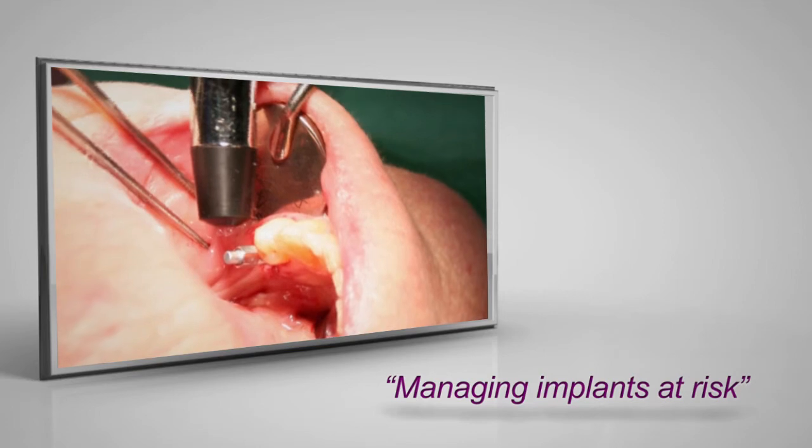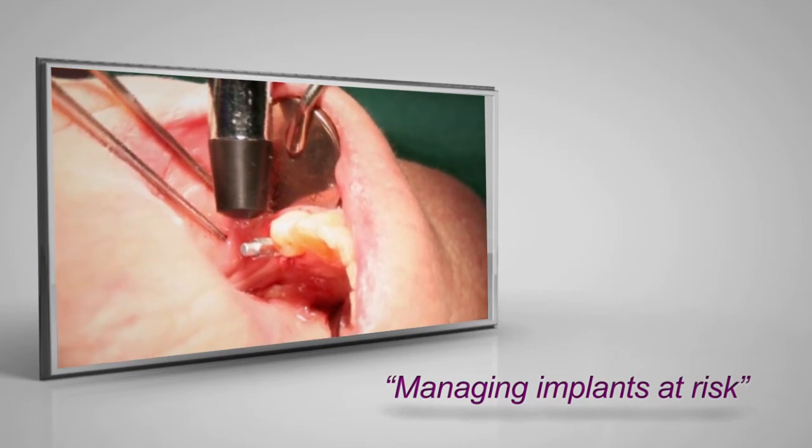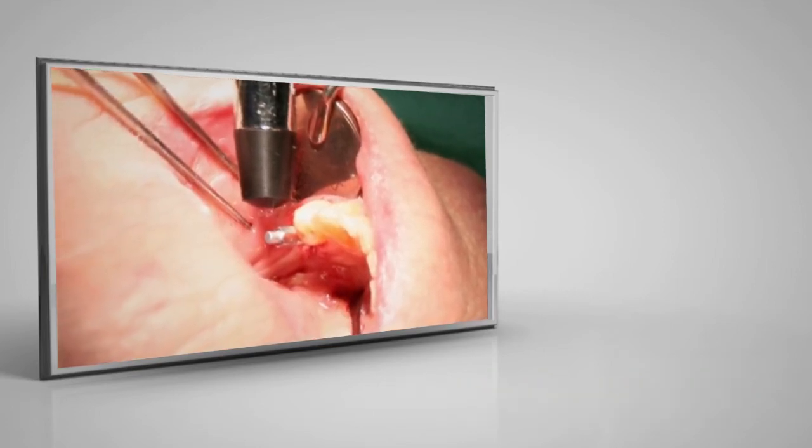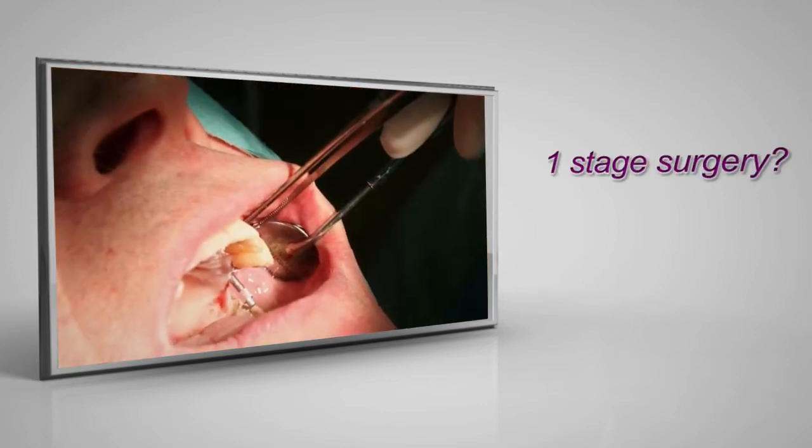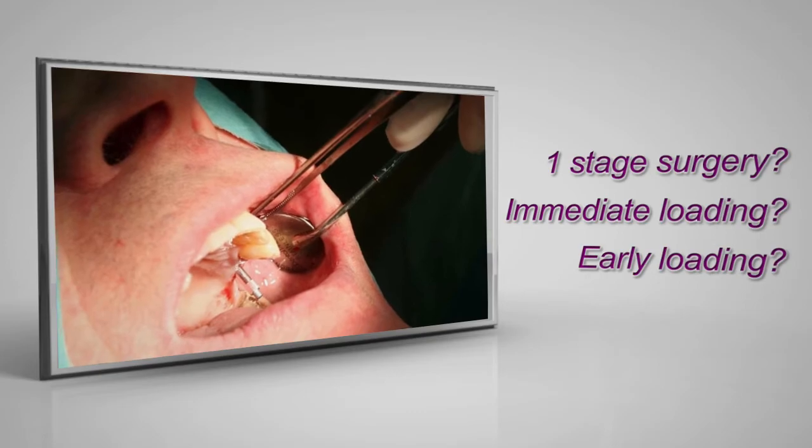You will find it especially valuable if you have implants at risk, but ISQ values can also help you reduce treatment time by letting you know if the implant is stable enough for one-stage surgery and immediate or early loading.